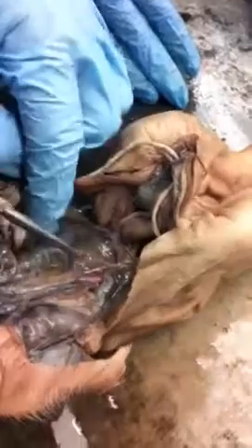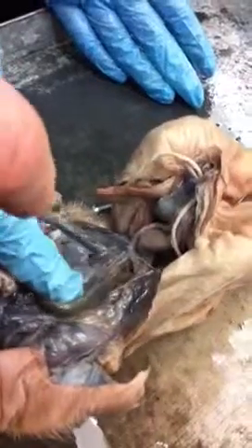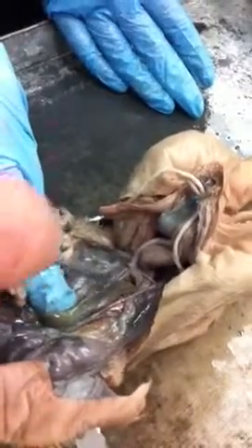Just have to find the other side. You can see one of them. That's the common iliac there. There's the other ureter. Let's look in here. Okay.